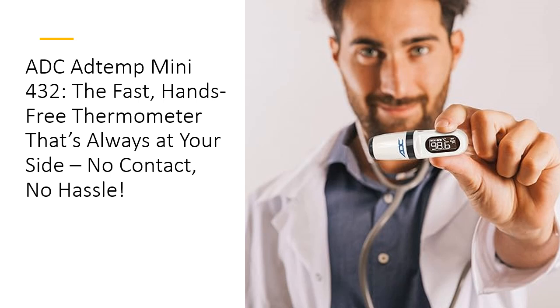What truly sets the AddTemp Mini 432 apart? It's always there when you need it. The convenient breakaway lanyard clip keeps it accessible, so you're never scrambling for your thermometer again. Measuring only 3.5 inches and weighing a mere 1.6 ounces, it's compact and lightweight yet packed with powerful features. Simply clip it on and it's ready to go wherever your work or family life takes you.